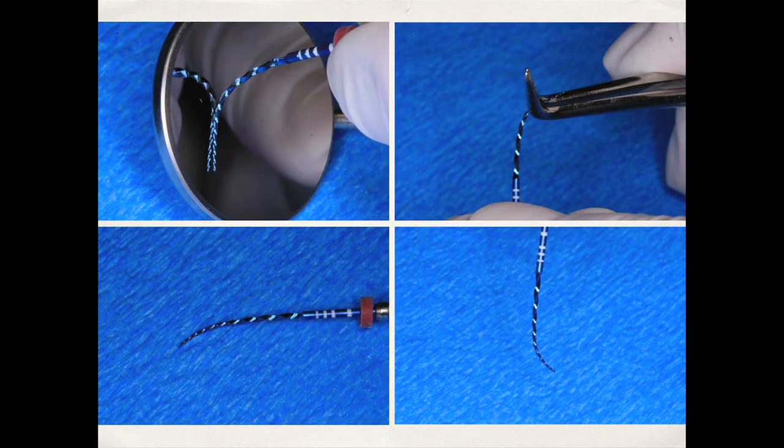These slides graphically display the flexibility of the Vortex Blue files. The proper way to pre-curve any instrument — whether Vortex Blue or a hand file — is with sterile cotton forceps, as shown in the upper right. You put a gentle curve on the instrument as shown in the bottom left. These files are extremely flexible, which is a tremendous advantage. It shows how the file can adapt to curvature in constricted canal space.